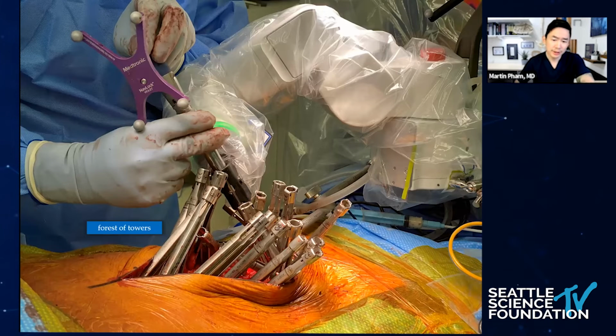Next, you can see here just this forest of towers, which is already daunting. The fact that the screws are already planned, though, just makes this the result of it, right? It's not something to be scared of because I already know where the screws are going because I planned them.